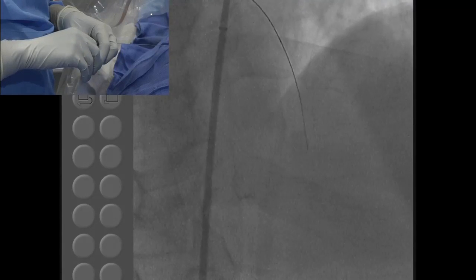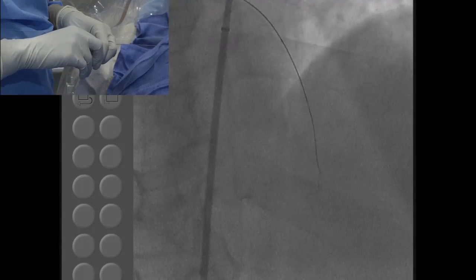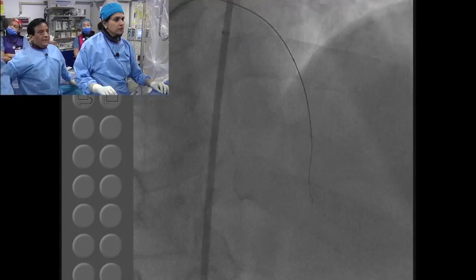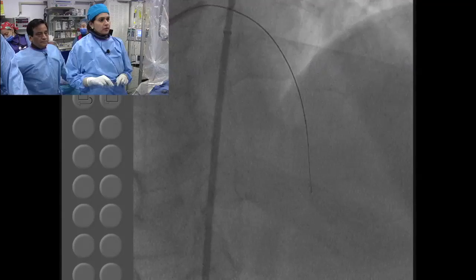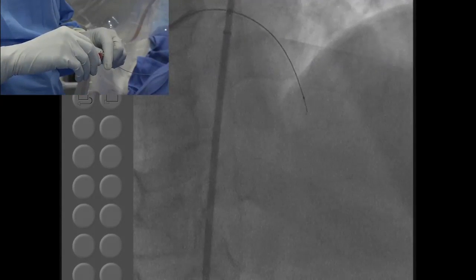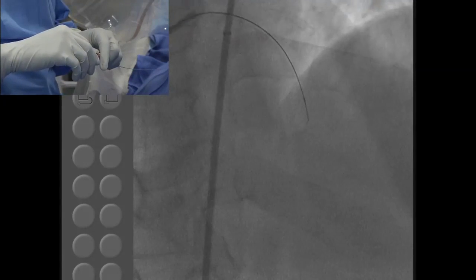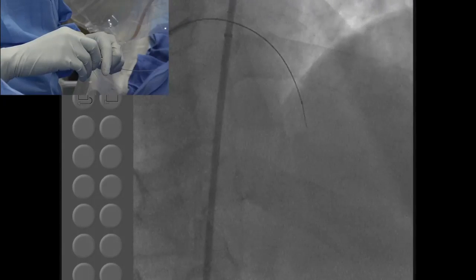And too bad here, you cannot have the help from your contralateral, because there was absolutely no flow in the diagnostic and the previous PCI as well as today. There's no backflow, no retrograde collaterals. And anytime, as you saw the movement of the wire, it tells you that a long length of the wire has gone subintimal. The wire sticks, and you cannot pull it out.